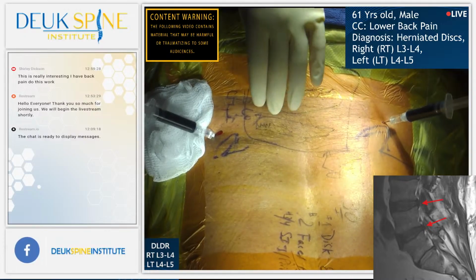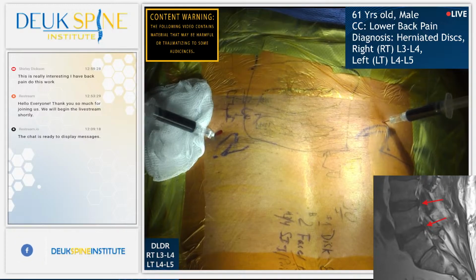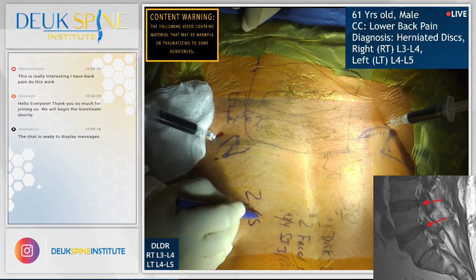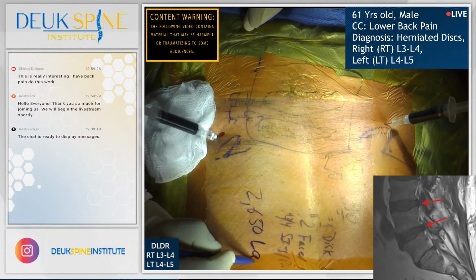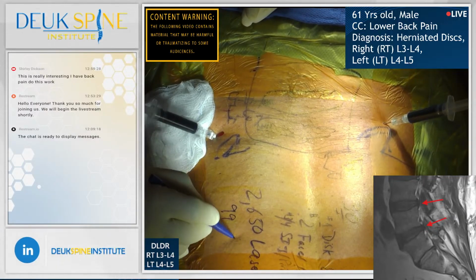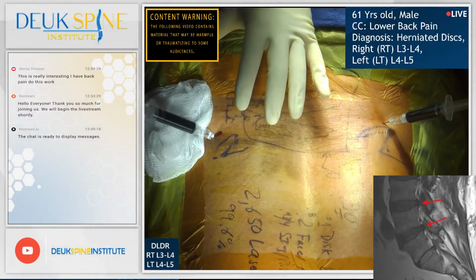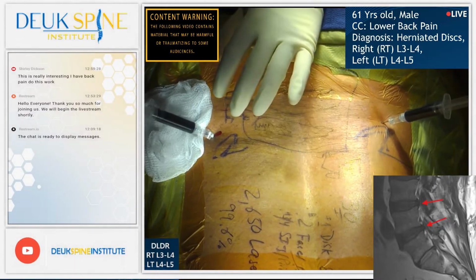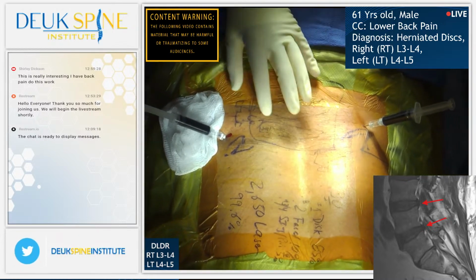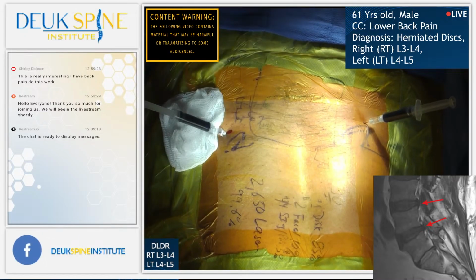We've been cleaning these tears with a laser endoscopically for 20 years. We've done now more than 2,650 surgeries with laser, and our cure rate of back pain is 99.6%. That means if you take this patient with back pain that's debilitating, destroying his quality of life, you do the laser surgery on the 2 discs that we know are causing his back pain, we expect 99.6% of his back pain to be gone.